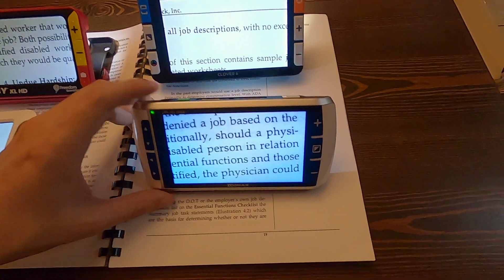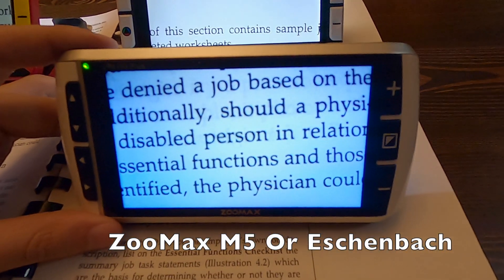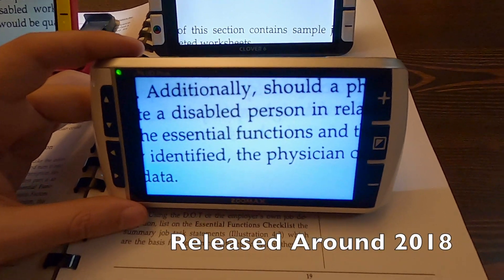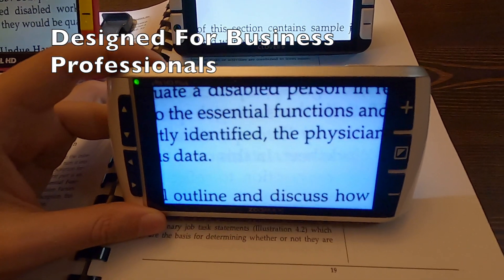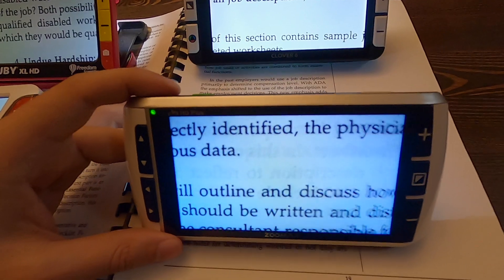Then you get to the Zoom Max — this is the first magnifier Shender and I've seen where the buttons were more black and white. This looks more like a device for an adult. The Eschenbach came around the same time; they were competitors, still are, but that's kind of your first business professional video magnifier.